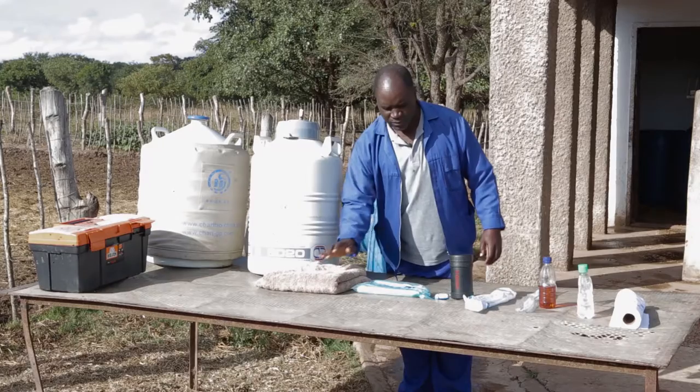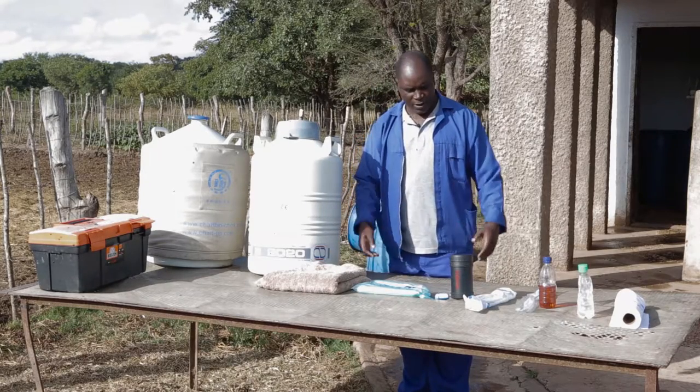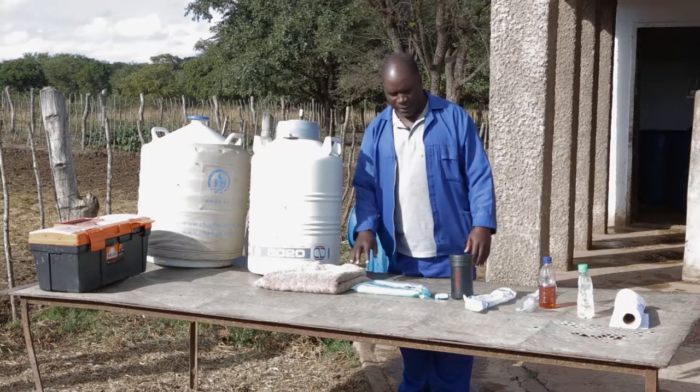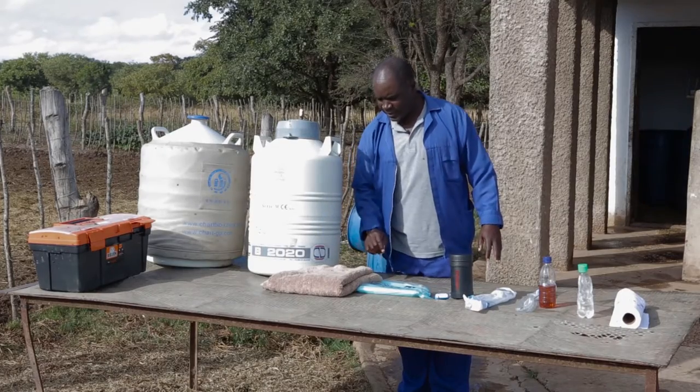This is a towel where we lay our equipment on so that it is not contaminated.